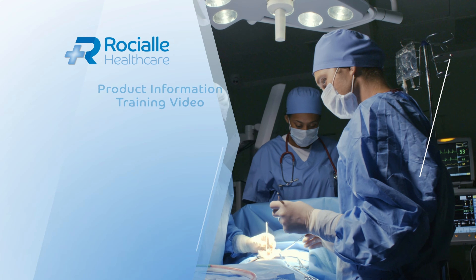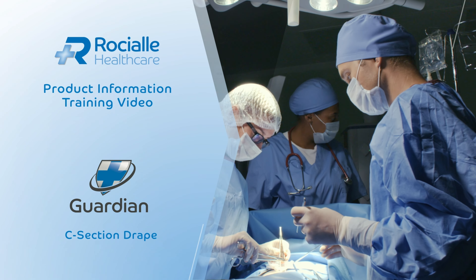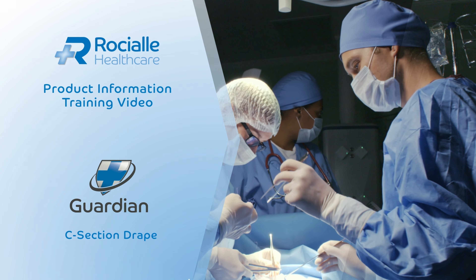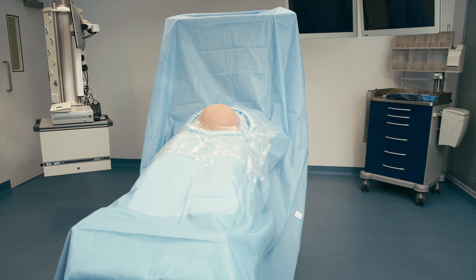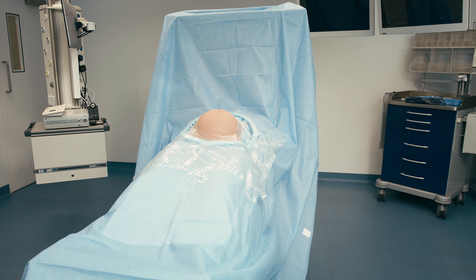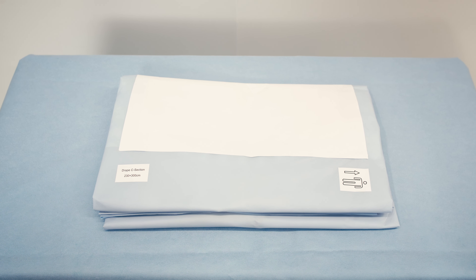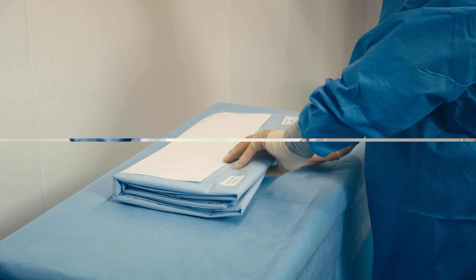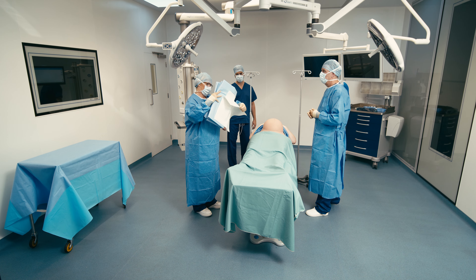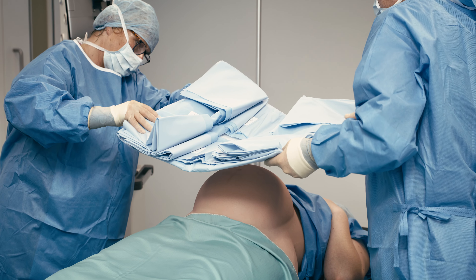This is a Rochelle Healthcare product information training video for the application of the Guardian C-section drape. Before applying, ensure the drape is in the correct orientation as indicated by the directional diagram. Remove the adhesive cover from the incise area and then place on the patient's abdomen.